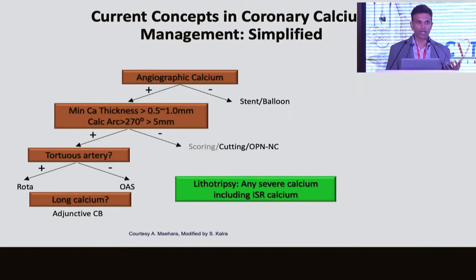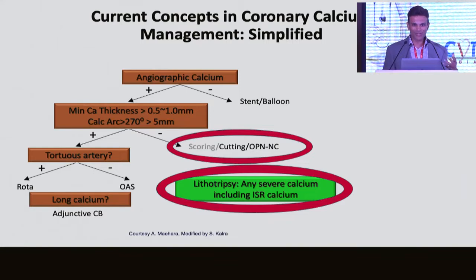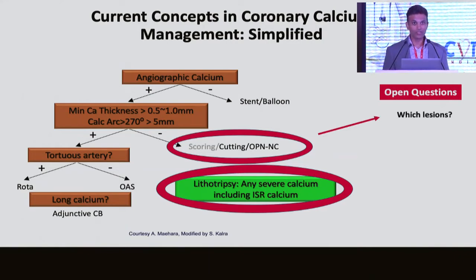Is it time for us to ask the question, when do we use which tool, right? It's sort of shocking that we're asking this in 2022 when we've had these tools for a long time. So these are the open questions. Which lesion do you use what balloon?